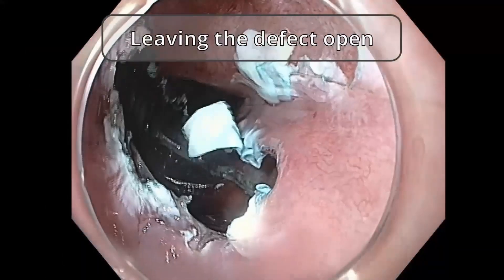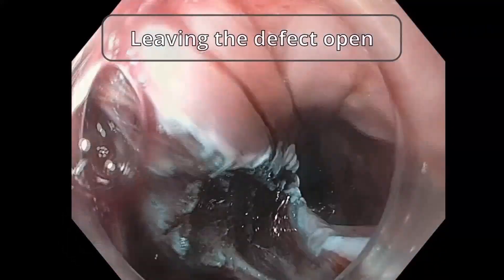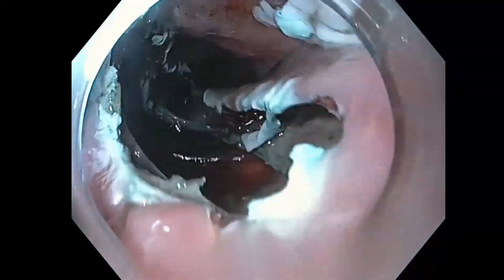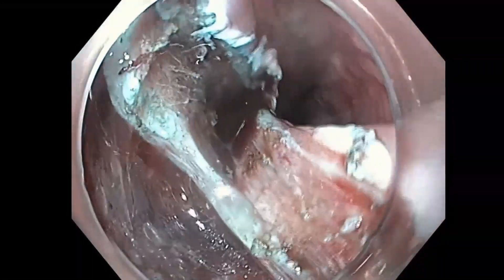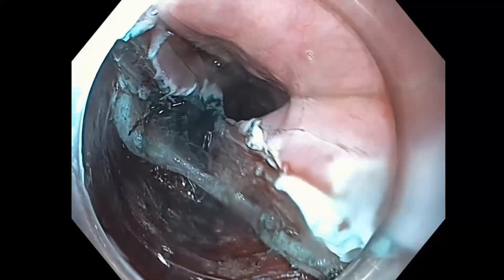Finally, the defect is left open and no clips are used for incision site closure. Leaving the defect open permits the extension of the mucosotomy and removal of any mucosal flaps, potentially decreasing the recurrence rate. Skipping endoscopic clip usage can substantially reduce the procedure cost and length. As submucosal tunneling is performed and the endoscopist is able to control any additional injury, the risk of perforation is minimal.